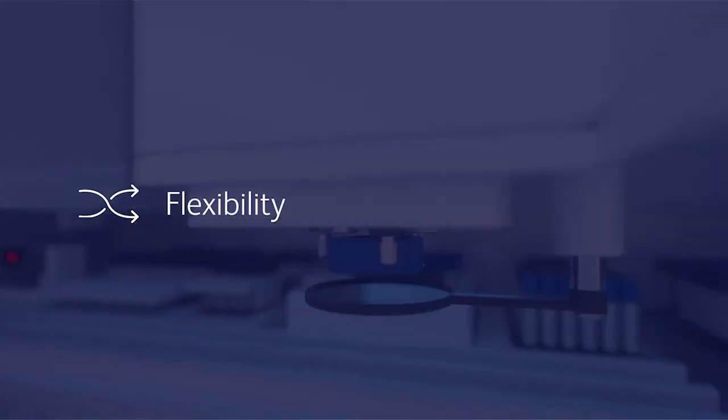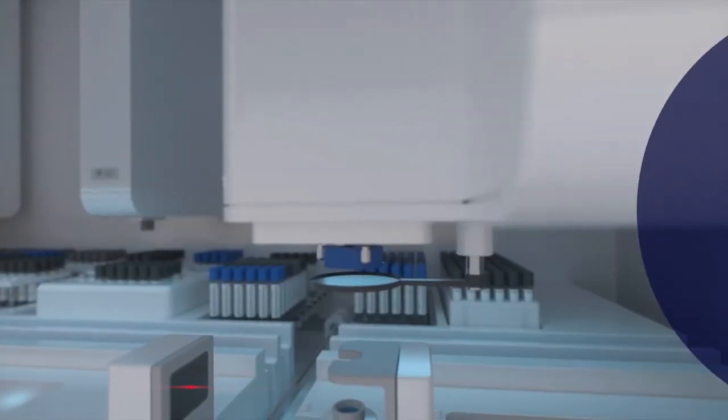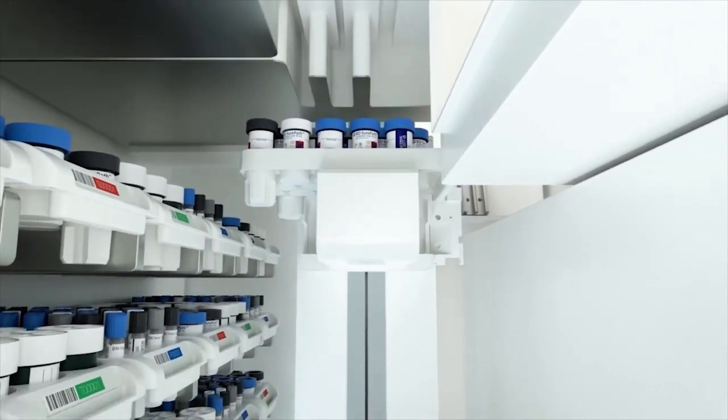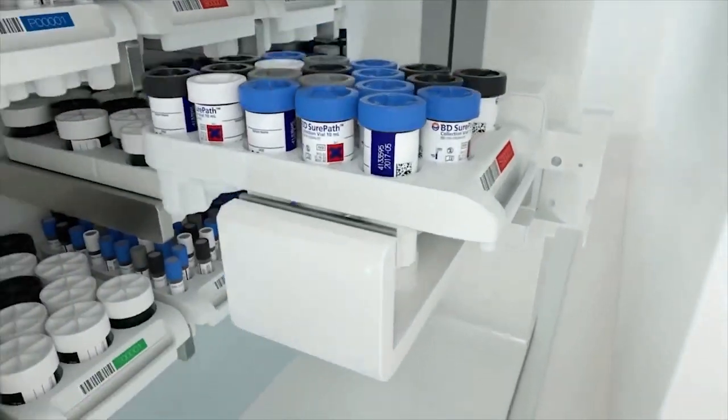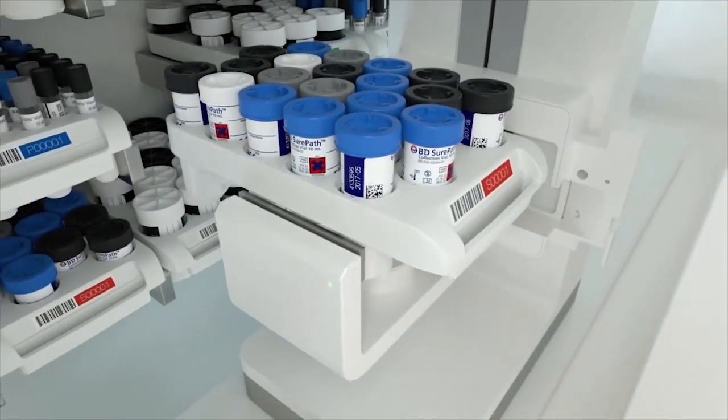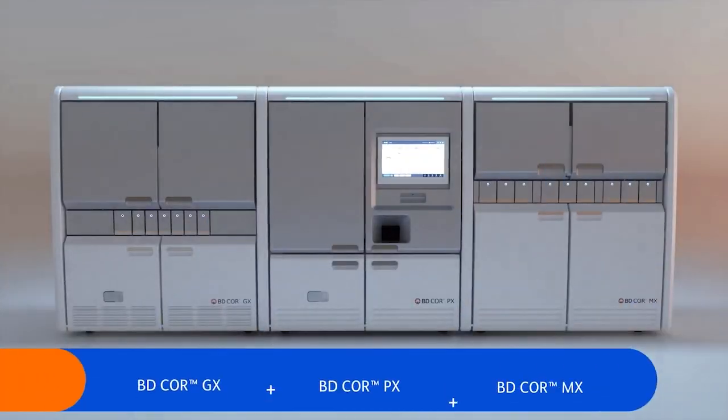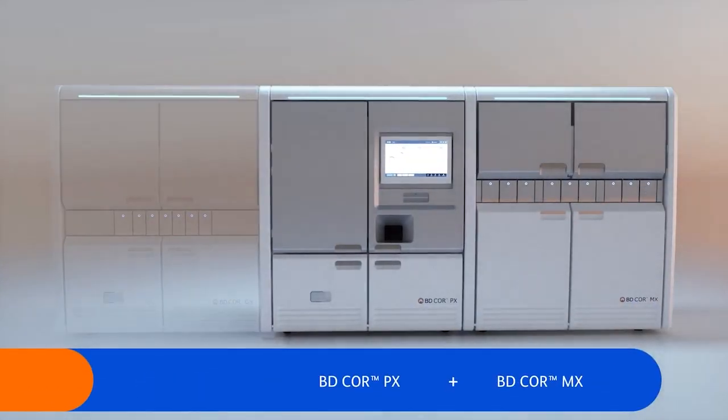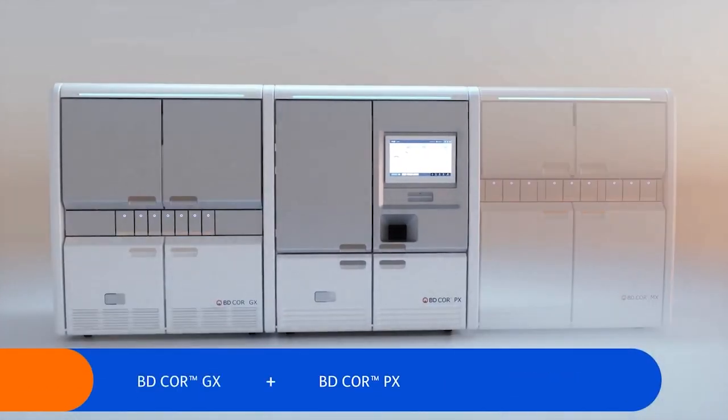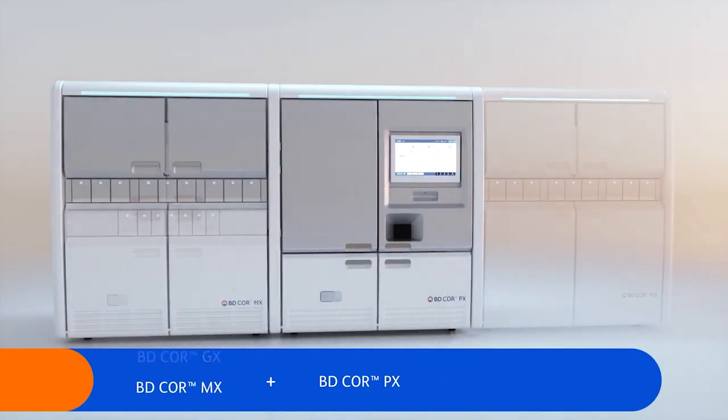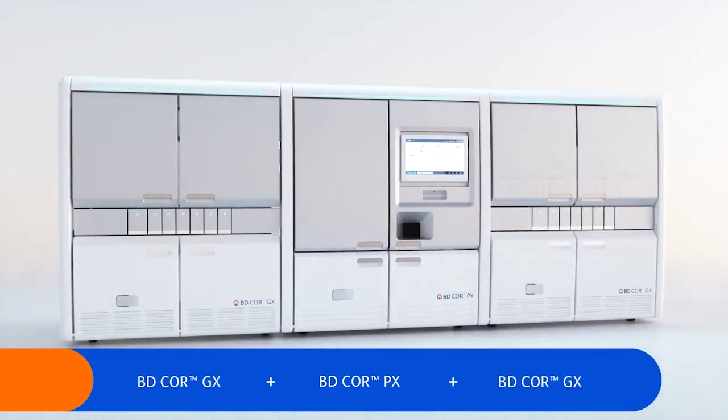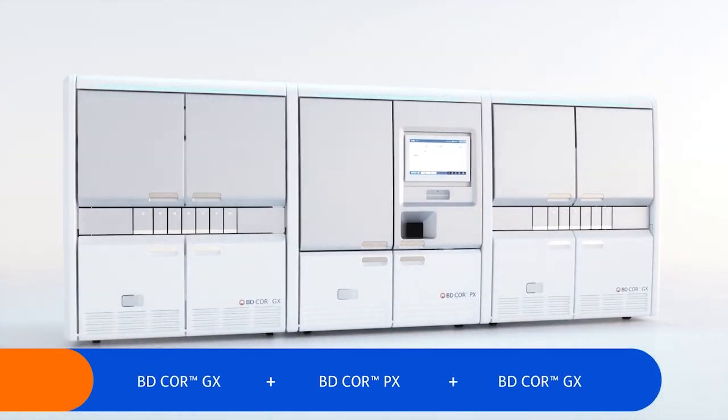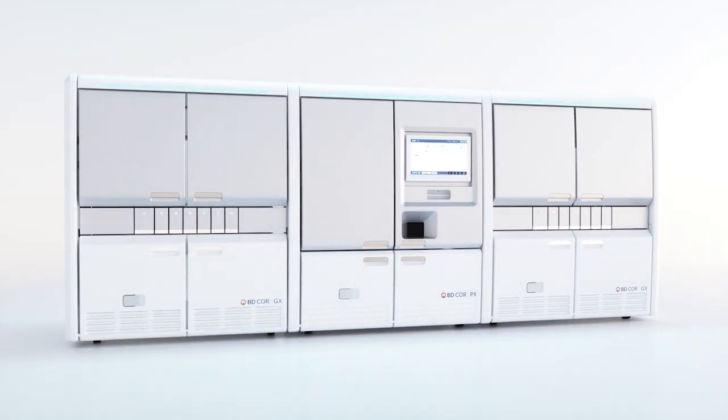It allows both random and continuous access with the ability to prioritize samples for testing, and the BD Core System is scalable and modular, allowing multiple configurations to meet the testing needs of your laboratory.